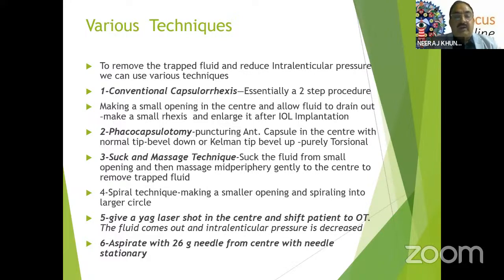These are: first, conventional capsulorhexis, which is essentially a two-step procedure, making a small opening in the center and allowing the fluid to drain out slowly. This is a passive method which allows the fluid to drain out on its own, and then make a small rhexis. And once the IOL is implanted, enlarge it.